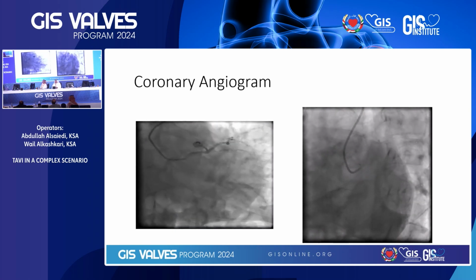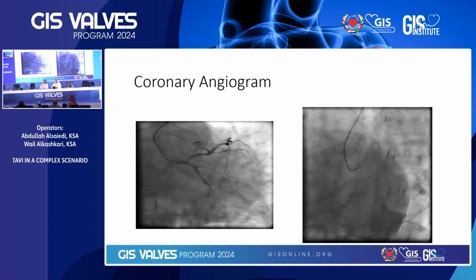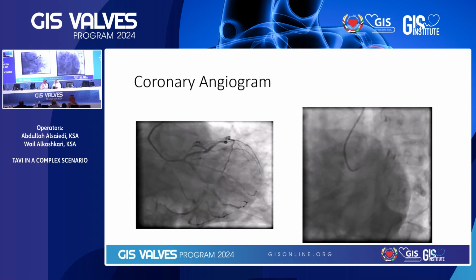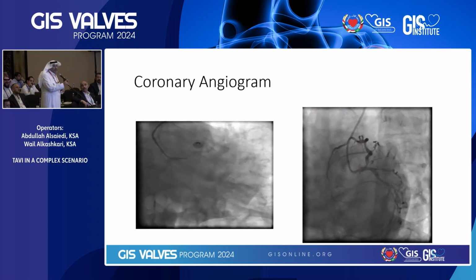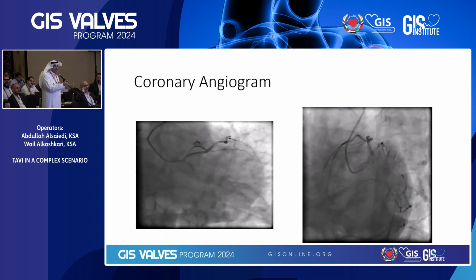So Faisal, that's a very valid point, but tell us what's your approach and which valve? So not to dwell, again, Dr. Mohammed highlighted important points, as the panelists and you guys. I ask your opinion, Faisal. I know. So this is a bicuspid valve type 0, and again, there is limited data for certain platforms.